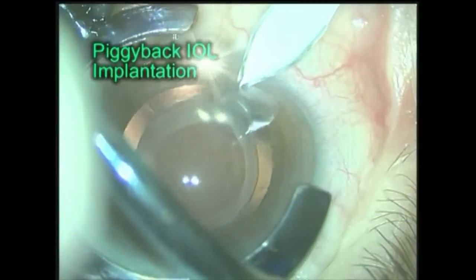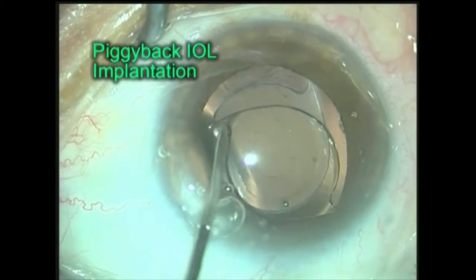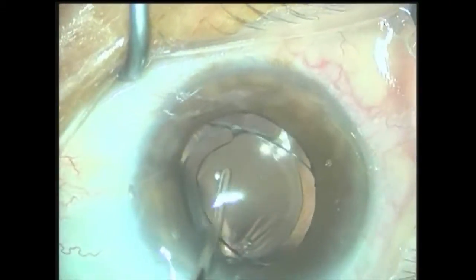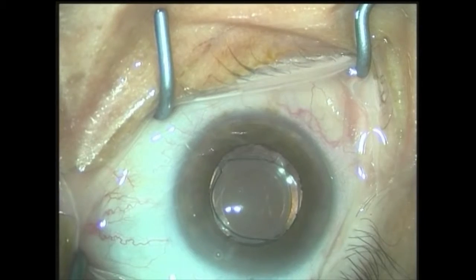The patient underwent uneventful piggyback implantation of a one-piece PMMA lens with ovoid optic, with corneal paired incisions intended to correct her astigmatism. On the first post-operative day, she reported that her symptoms were gone and she had a best-corrected visual acuity of 20/25.